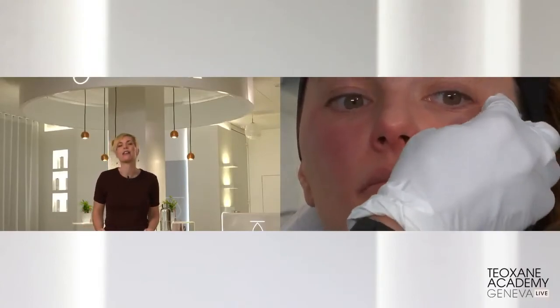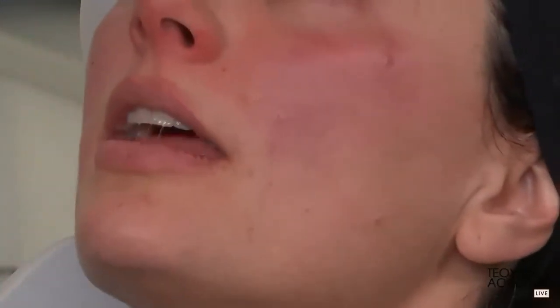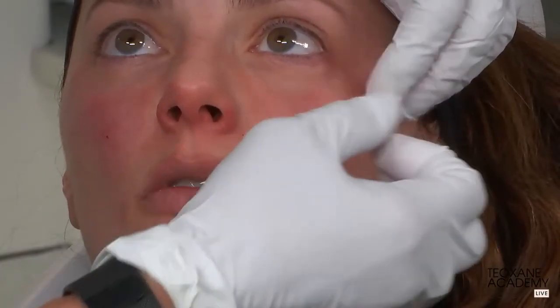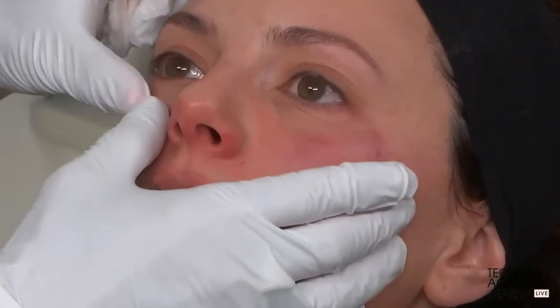Let's just go back quickly to the orbicular ligament. The question is, doesn't the orbicular ligament tear too much with this manipulation, and is it painful? We could ask the patient how painful this treatment was. It was painless. Tu sens un peu. Wow, ça fait pas peur. Oh, très peu. She said that it's very little. But there is a trick to this.